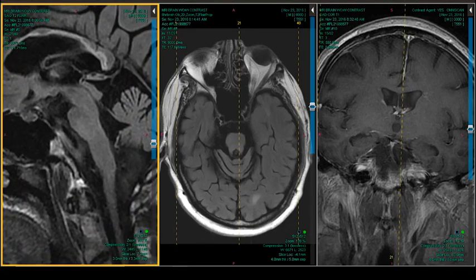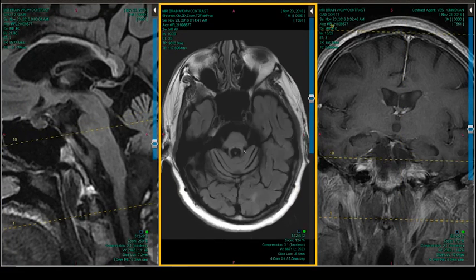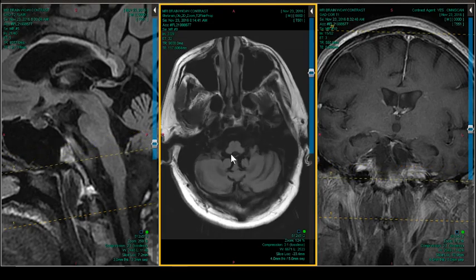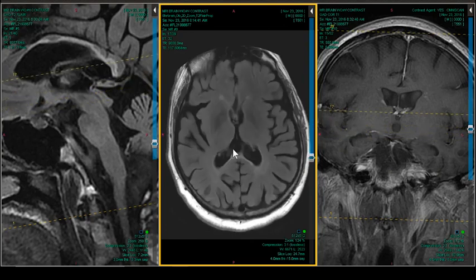The cerebellum is involved. A lot of places, a lot of anatomic areas are involved. I mean, look at the brachium conjunctivum, the superior cerebellar peduncle. Let's check out the middle. That's atrophic, the middle cerebellar peduncle. How about the restiform body? Wow, look at that. Looks stretched out. Not as small as the rest. The olive is flat. The olivary sulcus is a little shallow. The cerebellum, the vermis, and the hemispheres are involved. So we could do an anatomic treatise on this case.